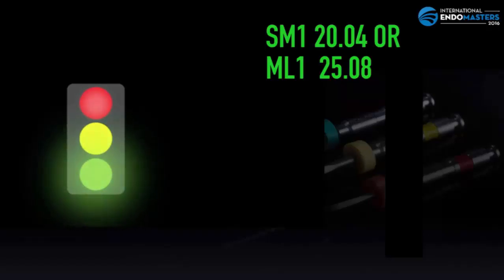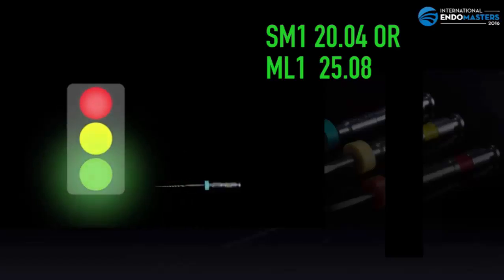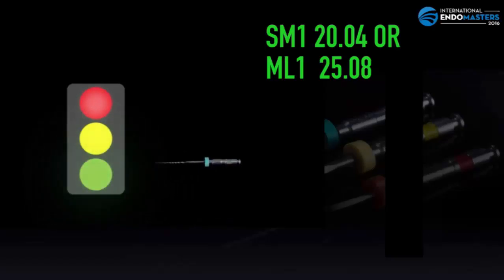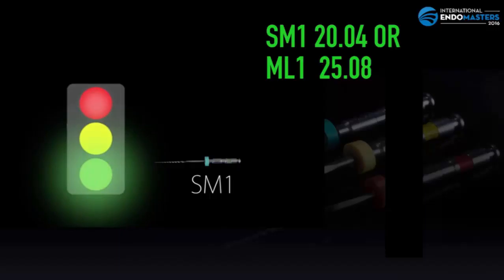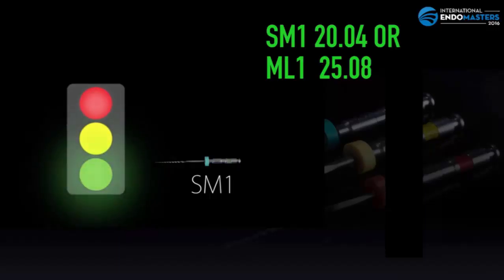The green means continue, and they have two greens in the sequence. The first one is the SM1 for the small sequence. This is a 20/04, or in the medium-large it is going to be a 25/08.